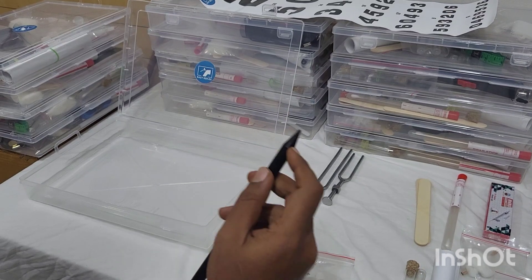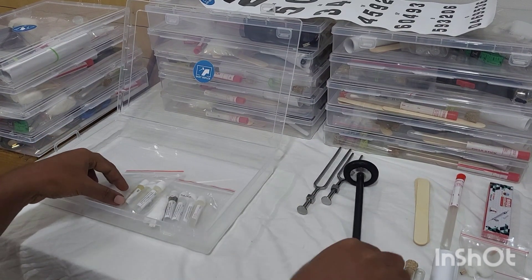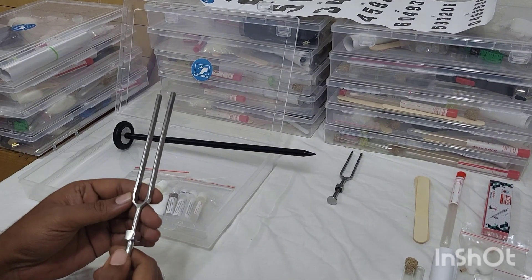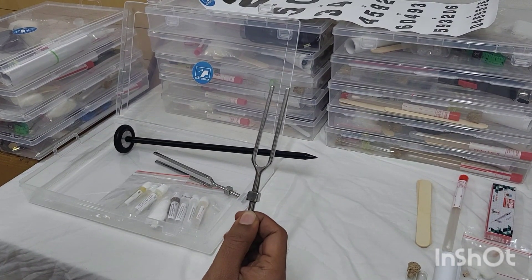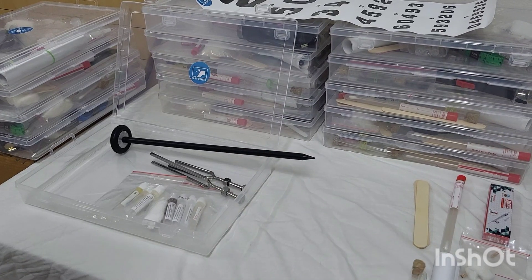Next we have your 128 Hz tuning fork, which we use for vibration sense. Next you have your 512 Hz tuning fork, which we use for Rinne's and Weber's tests.